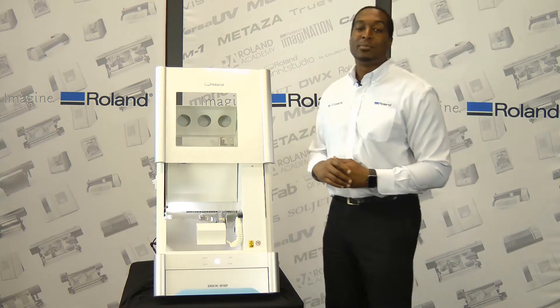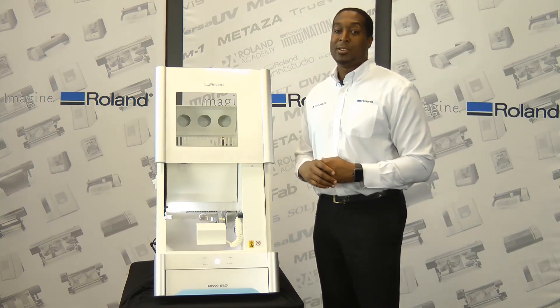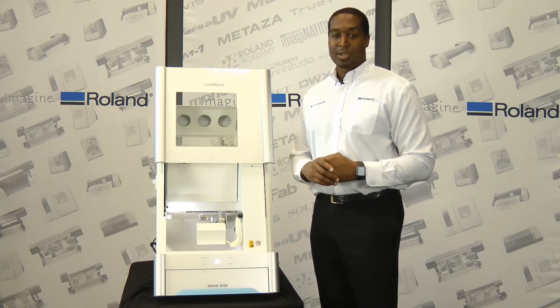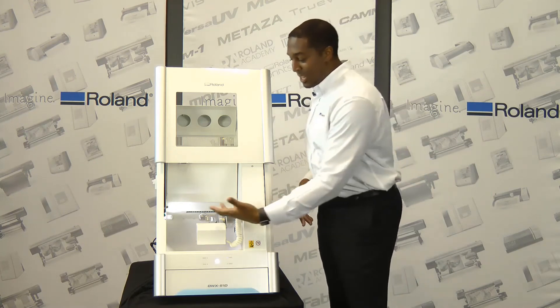Applications range from crown and bridge, inlays, onlays, screw-retained crown and bridges, partial frameworks, denture bases, surgical guides, night guards, and models.